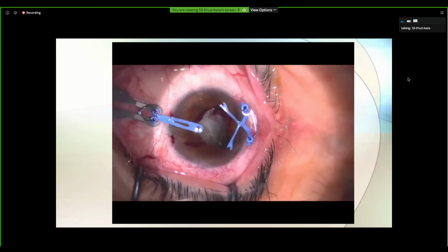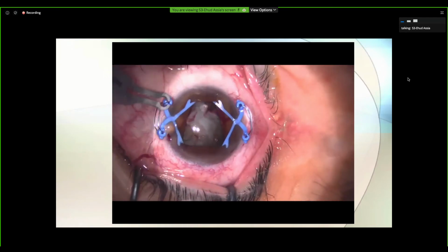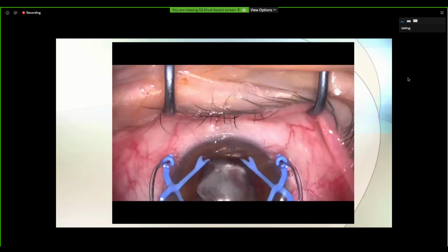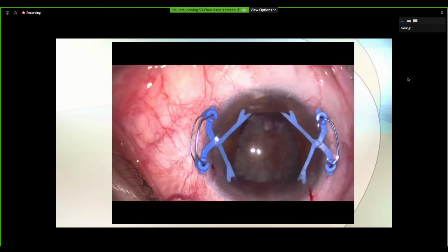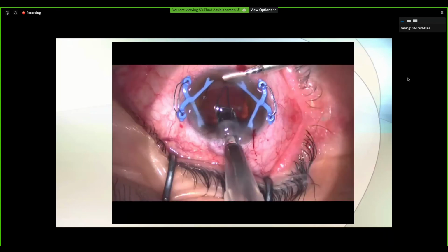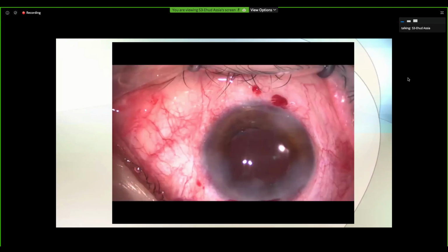And then we can see that this patient is after irradiation from melanoma. It has a fibrous capsule that we need to cut with scissors. So we must have a very good and stable and large pupil. We cut the capsule with scissors, take it out with forceps to see there is a very dense, hard nucleus that we can remove by direct visualization and implant a posterior chamber lens within the bag. And following the removal, the pupil again is going down a little bit and regains its normal configuration.